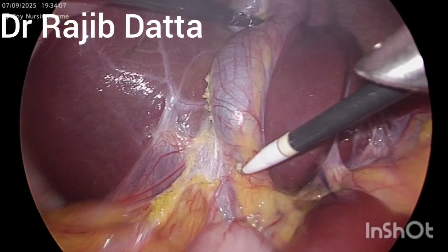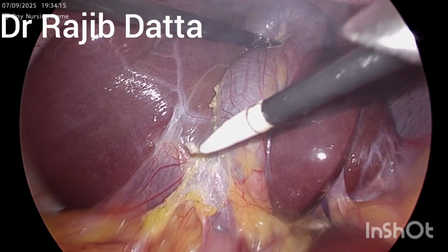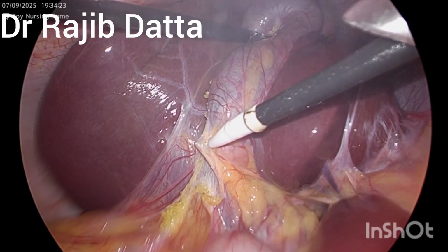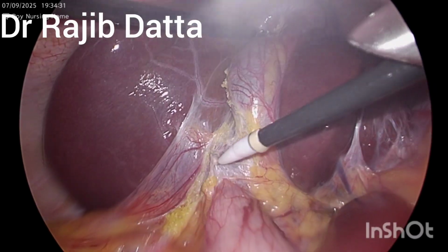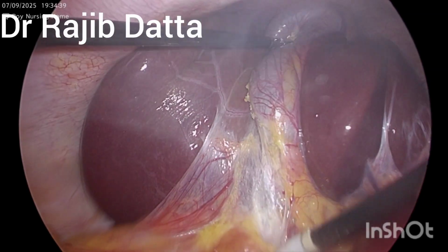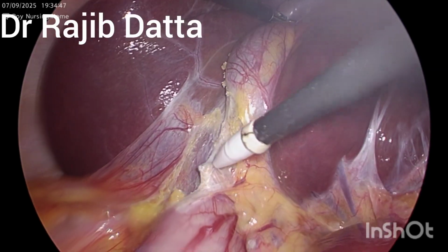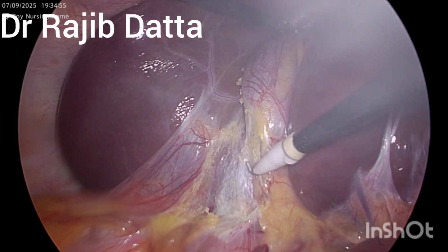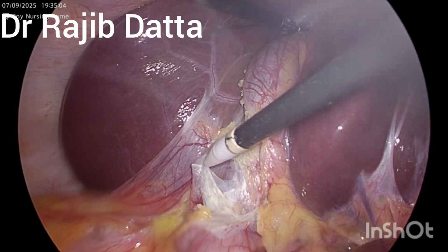So we are doing our job constantly and retracting this fibrofatty tissue from the gallbladder as well as from the liver bed, and with the elbow of this monopolar hook we are retracting our stomach and duodenum away from our operative field.